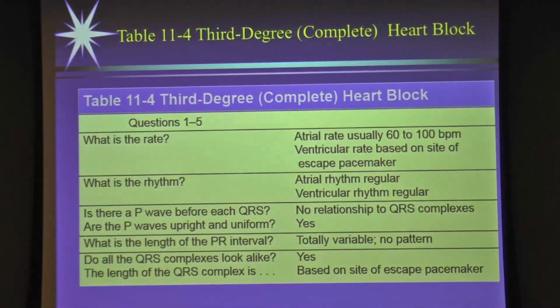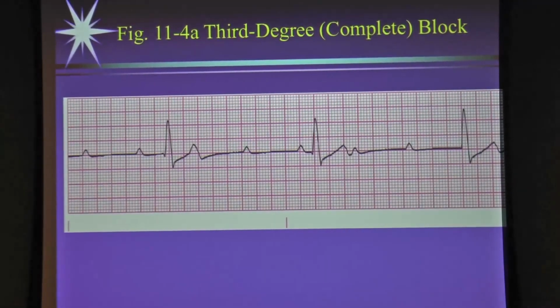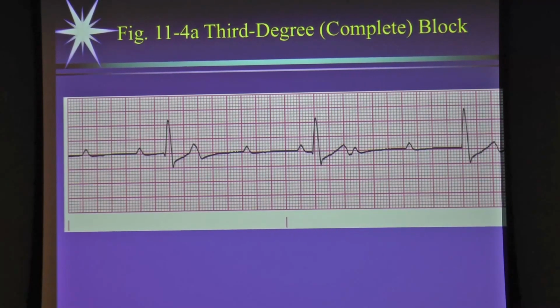And then the last one is a third degree heart block. Here, again, we have more P waves than QRSs, but what's different from the other one? No constant P to R intervals, right? So here the AV node has become a complete block, a complete wall, not letting any through. The atria are going to be firing regularly because they don't know that occurred, and the ventricles are going to hopefully pick up as the backup pacemaker, and they're going to be firing regularly. But again, when you have a P wave in front of a QRS, you'll see no constant P to R intervals. And if you really had time, you could map out the P to Ps, they would be regular, and you could map out the R to Rs, and they would be regular.